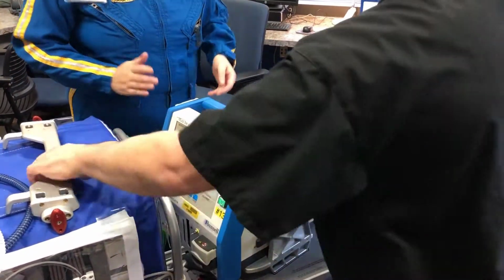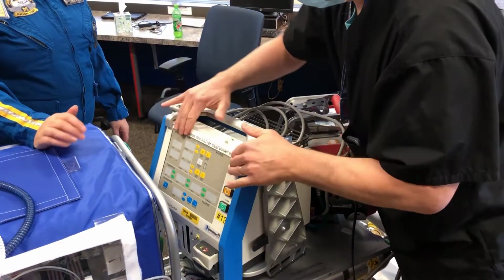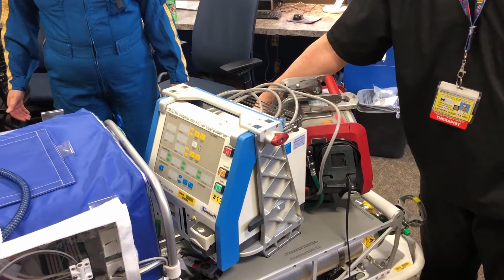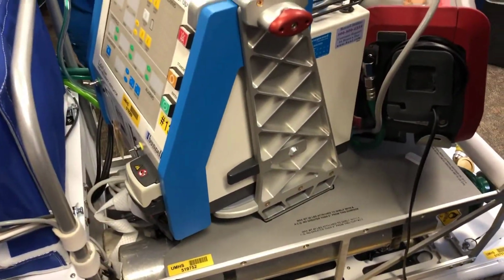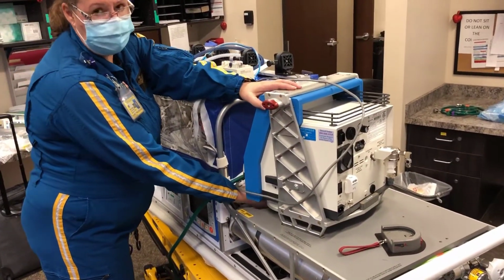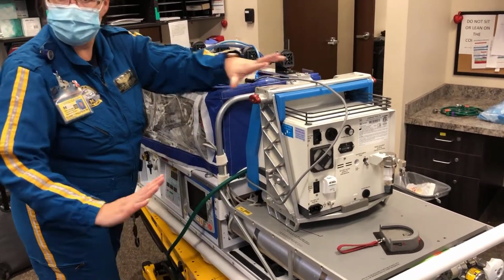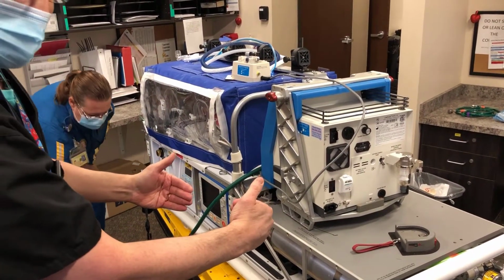Push it back. And you're locked. So your plug is in. You'll have to attach your high pressure oxygen line in the back, and then you can install your circuit and go from there. You may have to turn it a little bit more flush to start with to allow you to slide the Hamilton in, and then we can lock it back in place. Also for putting your cord in. Once you get the cord in, you can turn it and lock it back in place.